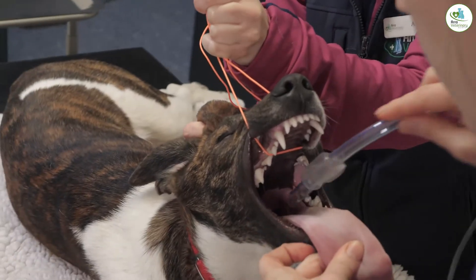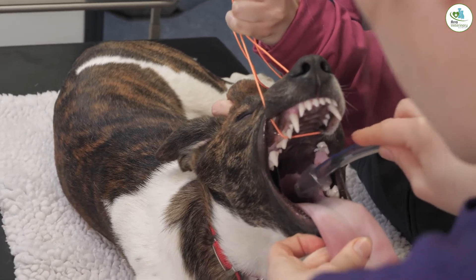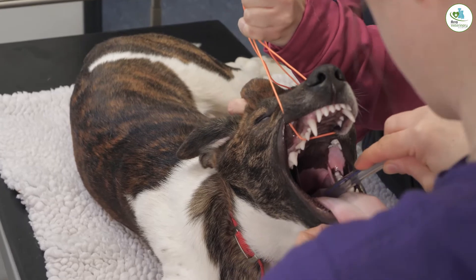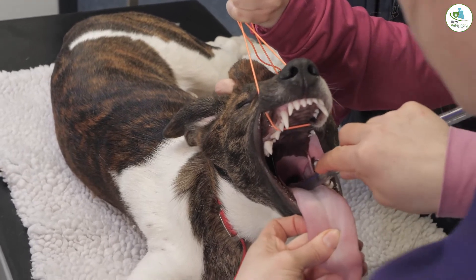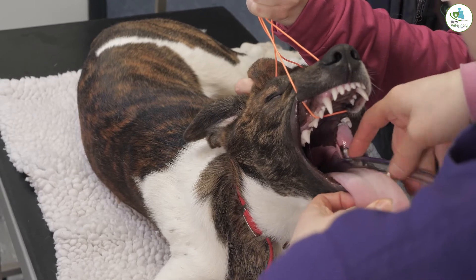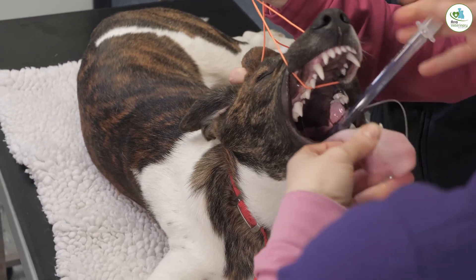We pull out the tongue and then we look for the epiglottis. We want to expose the epiglottis, which I have here, and we find the holes, which we have there. Then you pass your tube nice and gently down — that's perfect for Covey.